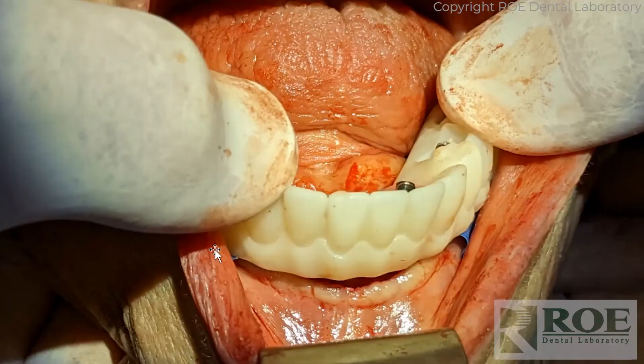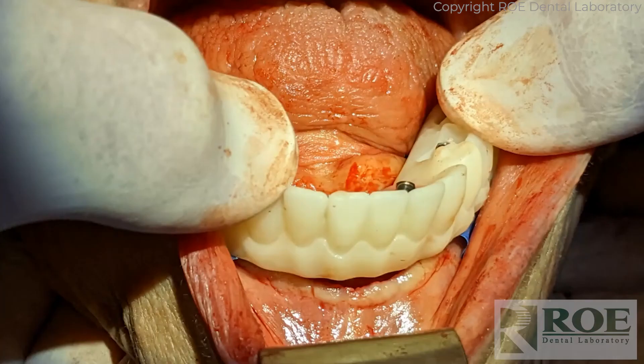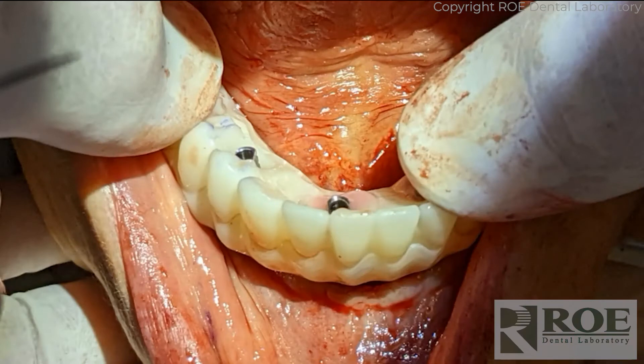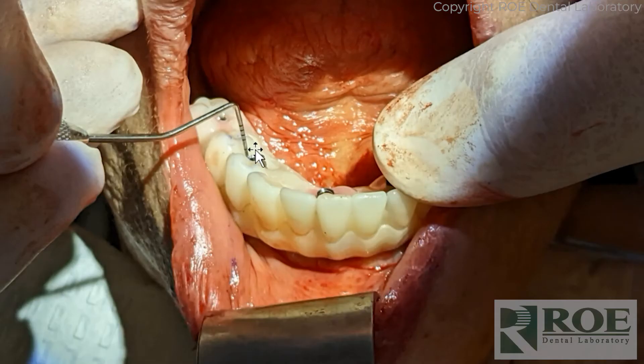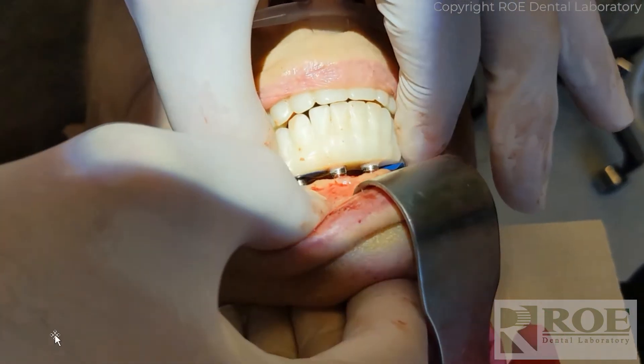Place the gaskets for block out. There's no carrier guide, but the block outs will still protect the abutments. You'll notice these already have temp cylinders in them, so sleeve the prosthetic over the temp copings and then screw down one, two, three — now it has a perfect positive seat. The prosthetic is fixed in the mouth, but take great care to make sure there is a gap around the other temp cylinders. You do not want this contacting the side of the prosthetic anywhere. We had to adjust one of the temp cylinders due to a slight angle.